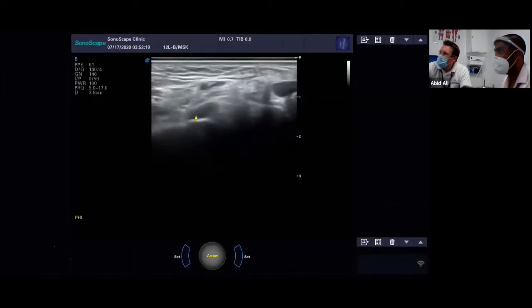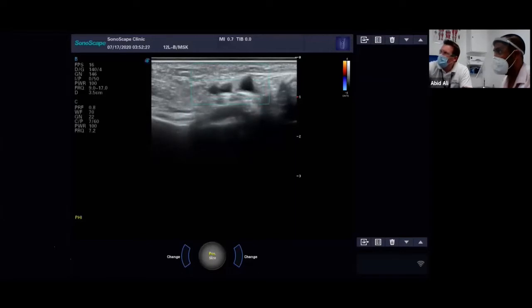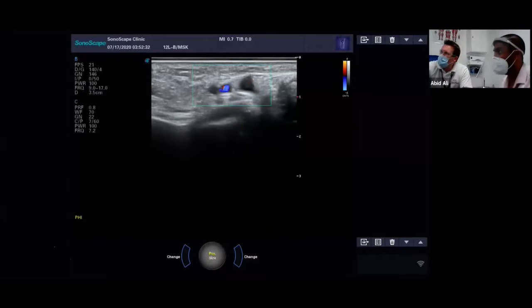Yeah, should we show them some flow there in the artery? You can see the movement pulsing away. You can. Let's show you some blood flow. So you see I'm on the normal colour flow here, and I'm just going to switch it to the power and see if that makes a difference. So I've got a bit more, so it's a bit more sensitive.